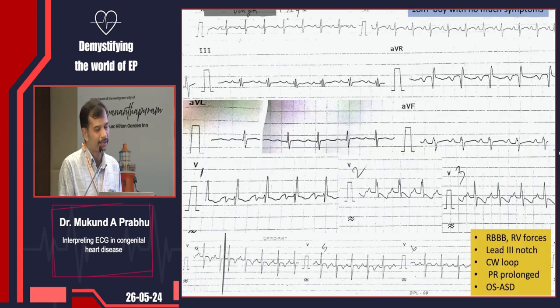As time permits, we'll visit some of these physiologies, starting with left to right shunt, ASD. A fairly simple clinical diagnosis, ASD. This 1.5-year-old asymptomatic boy with ASD findings. ECG is compatible with ASD: a sinus rhythm, a prolonged PR interval, RBBB and RV forces dominant, rightward axis. This prolonged PR interval may give additional clues like Holt-Oram syndrome or a familial ASD.